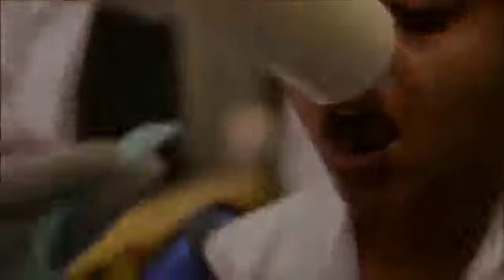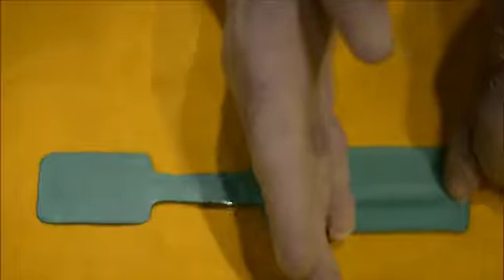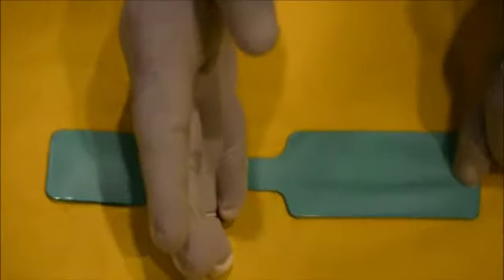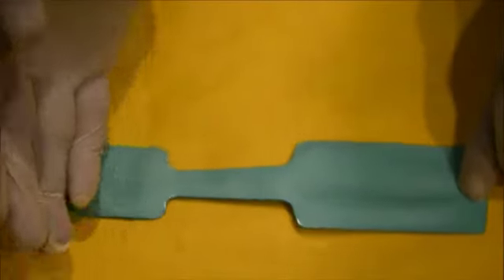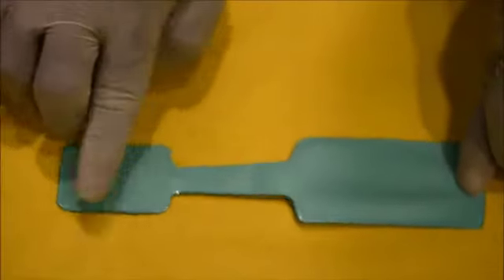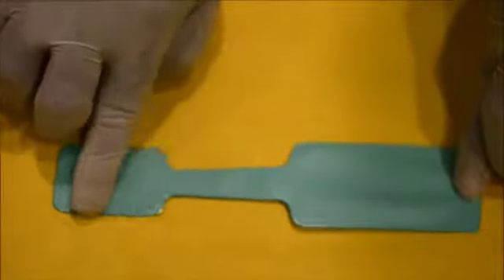Milk down the developer and fixer towards the film with firm hand pressure in sliding motion. Once the chemicals reach the film, massage it for 30 seconds.